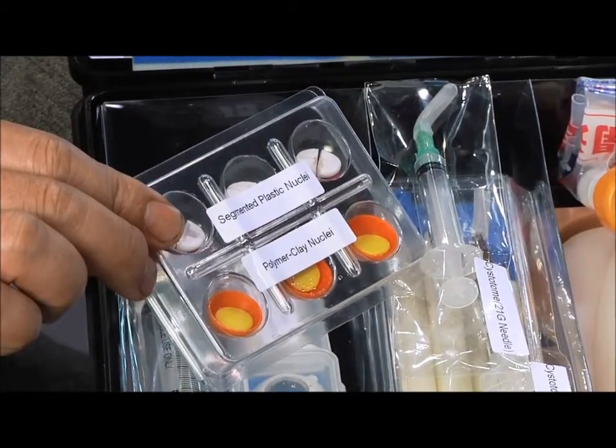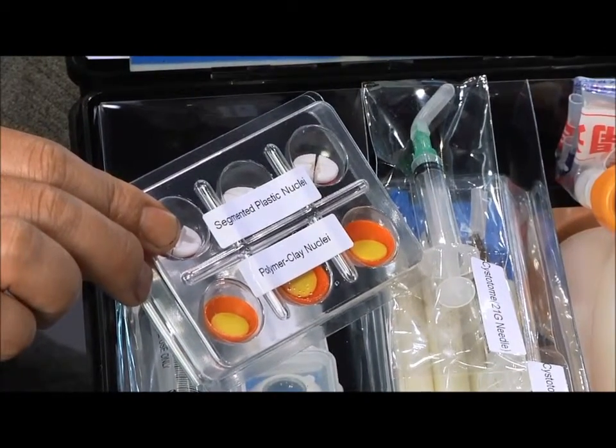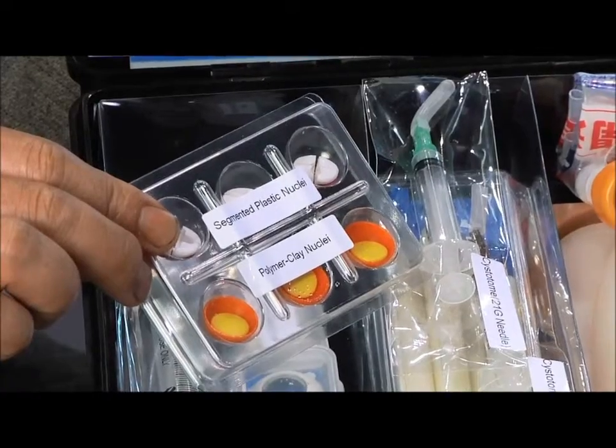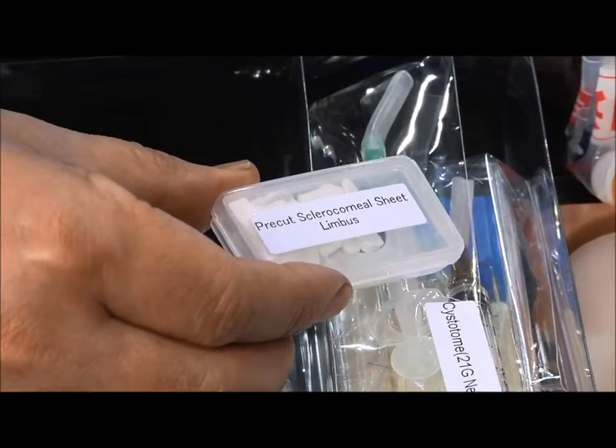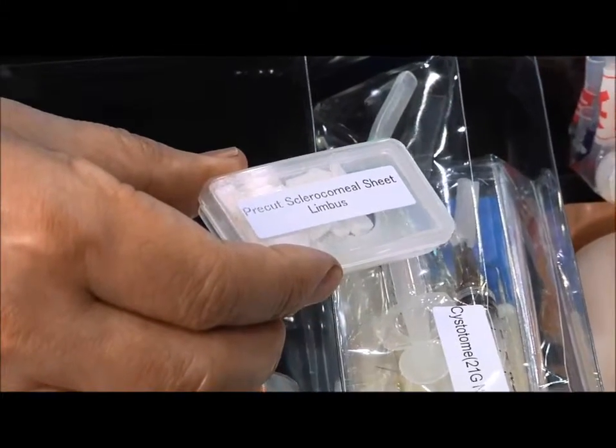After practicing with the segmented plastic nuclei, these same techniques are practiced on the polymer clay. The pre-cut sclerocorneal sheets attach to the cornea for practicing limbal incisions.